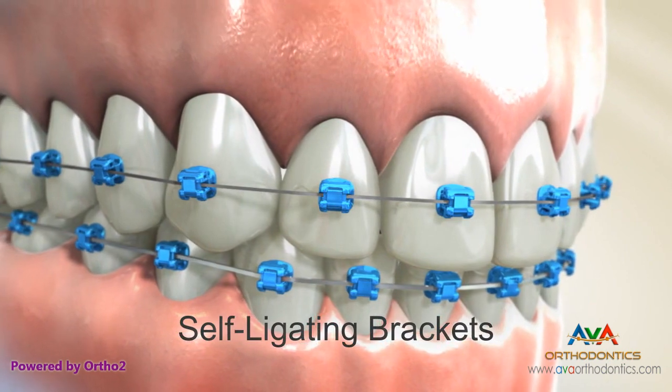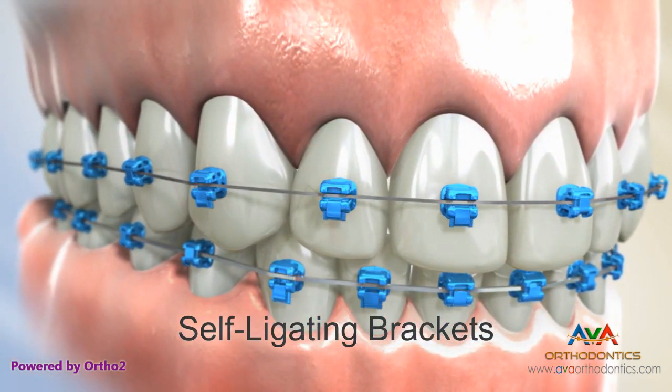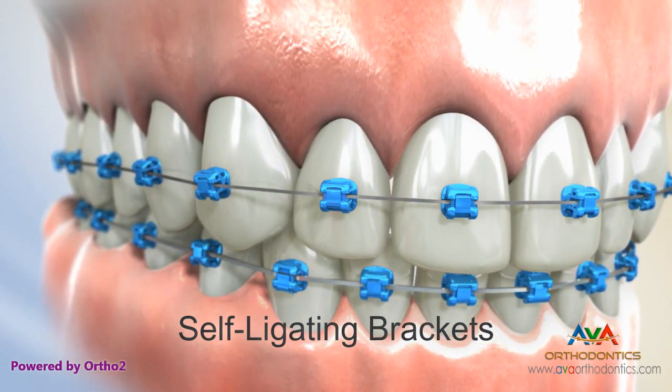Self-ligating brackets are bonded to the teeth just like twin brackets. The main difference is these brackets use a door or clip that closes to hold the arch wire in place rather than elastic ties.